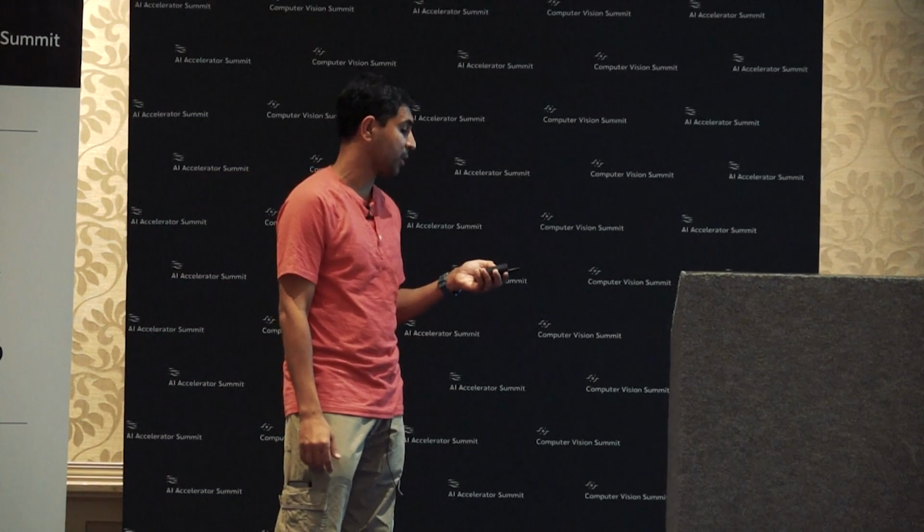And so instead of the surgeon having to watch through this, if you are able to segment the video, identify the step where the clipping is happening, and translate it to a score, that greatly helps the surgeon in evaluating this and taking the next step. So really, what we have tried to do in this example is to see how gallstones can be diagnosed with vision. It can help segment the workflow of the procedure during the intra-op, and how it can actually help in post-op analysis and in evaluating how the procedure actually was done.